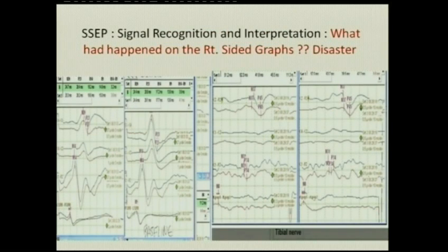If you want to look after the signals, I feel this is the duty of all of us in the operation theater to have a look at what is going on. These are the peripheral potentials, and gradually it goes up. You can see all the potentials; we make two runs to give you reproducibility, indicating that these are really potentials, not an artifact.